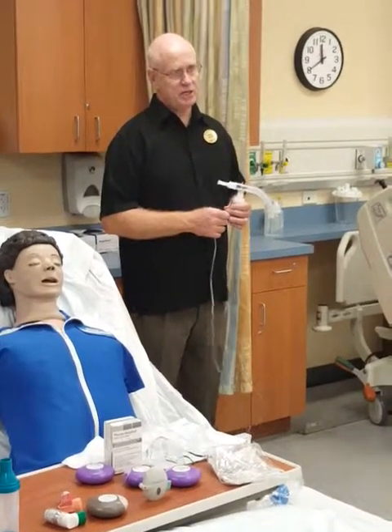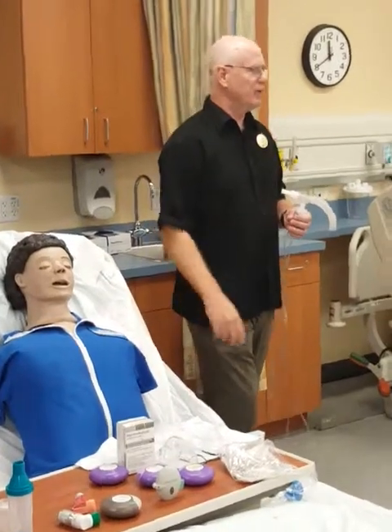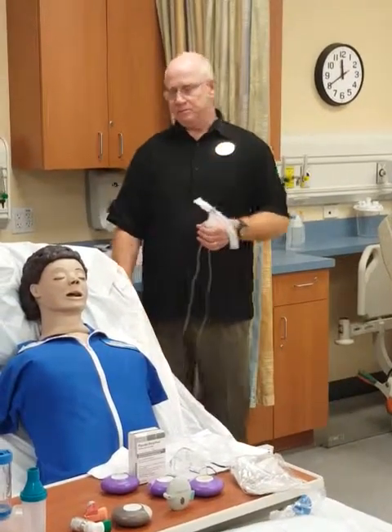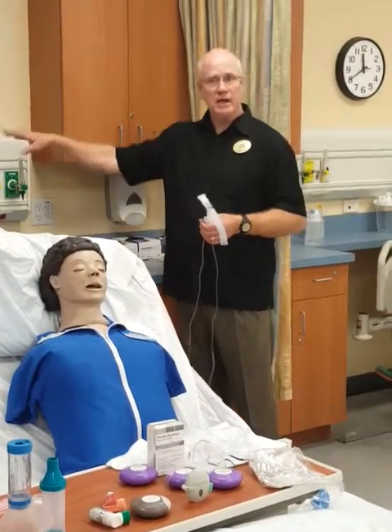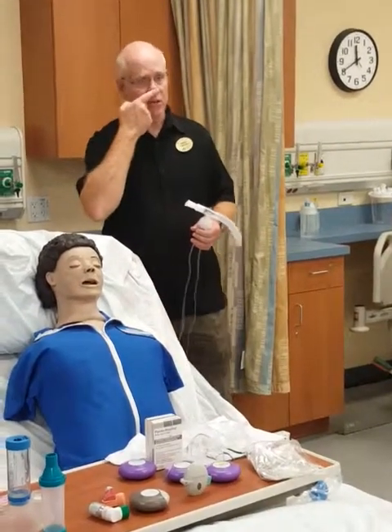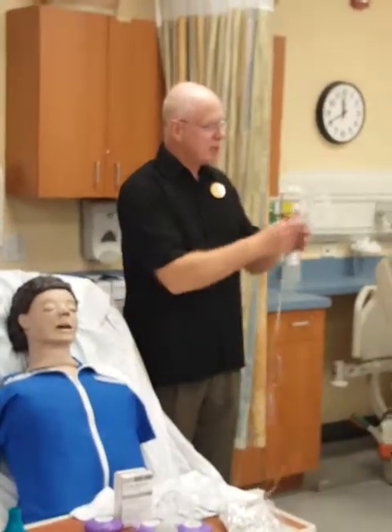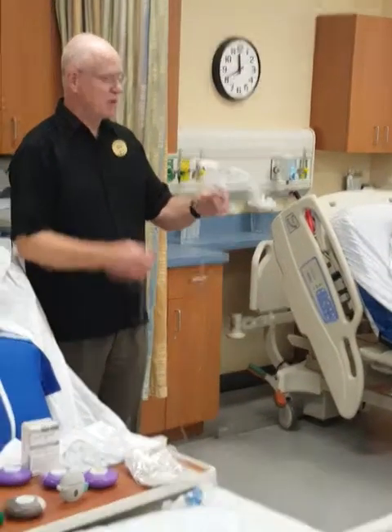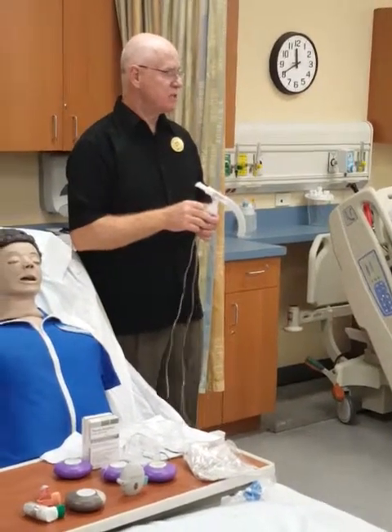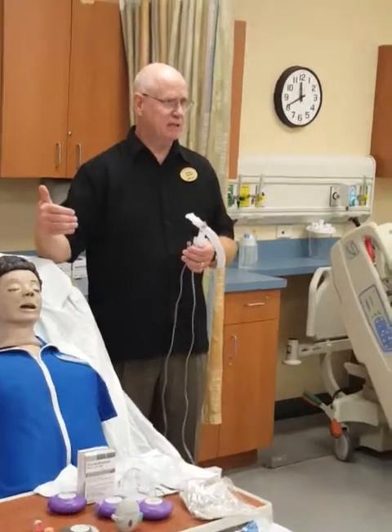Sometimes they're going to be on high concentrations of oxygen — like a non-rebreather mask, so you're dealing with 60-80% oxygen. That's a lot of oxygen. You take that off a patient who really needs it and they're going to be in trouble in short order. What you'd hope to find is a head wall with two oxygen flow meters. In a case like that, I'd hook up one flow meter to a nasal cannula at six liters, then on top of that give them this nebulizer — about 40% with the nebulizer and 44% from the cannula. You're not going to replicate the non-rebreather exactly, but you have to somewhat replicate it.